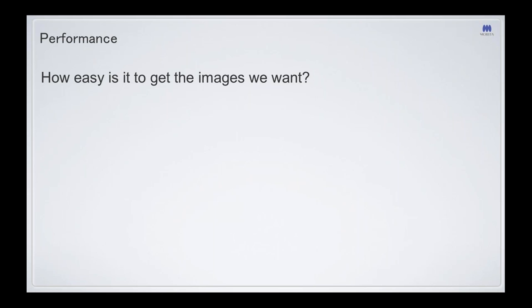And then keep in mind, how easy is it going to be to get the images you want? It's all well and good to have beautiful images on the screen, but if you can't get those images consistently, then it's going to be a problem for your staff, and it's going to be a problem for your diagnostic capabilities.